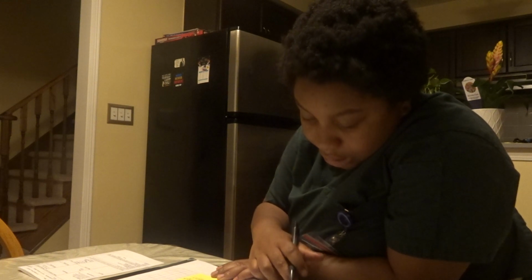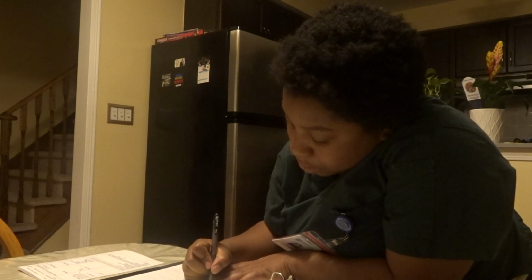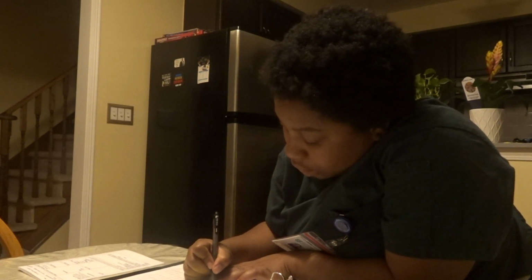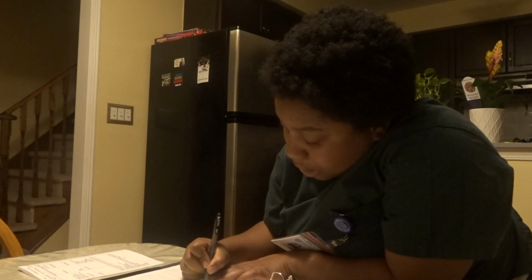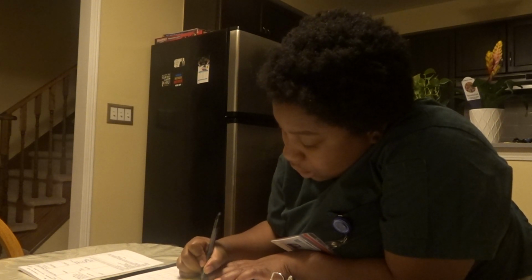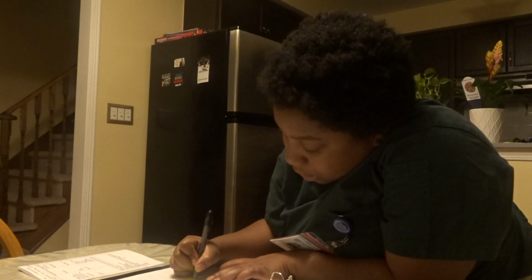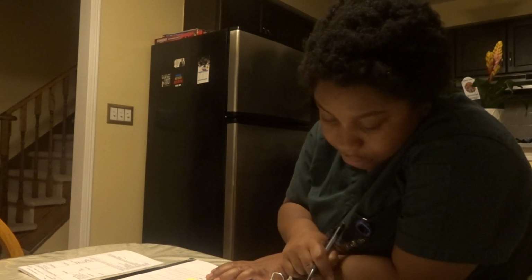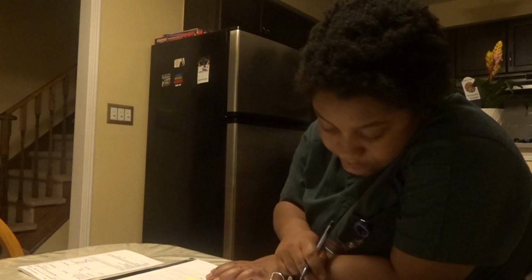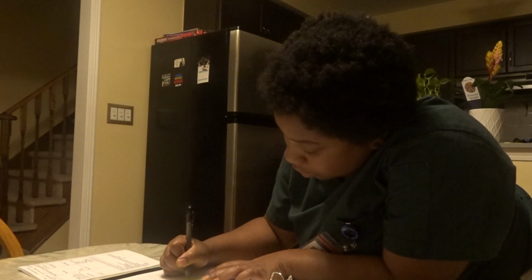And then I'm going to find out how long I'm going to infuse this for over an hour. So it's going to be volume over time times hour. So the volume is going to be 50 milliliters over 45 minutes times 60 minutes, and that's going to give me 50 divided by 45 times 60 gives me 67 milliliters over an hour.